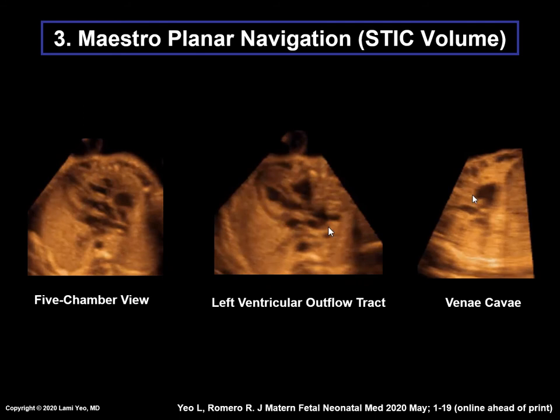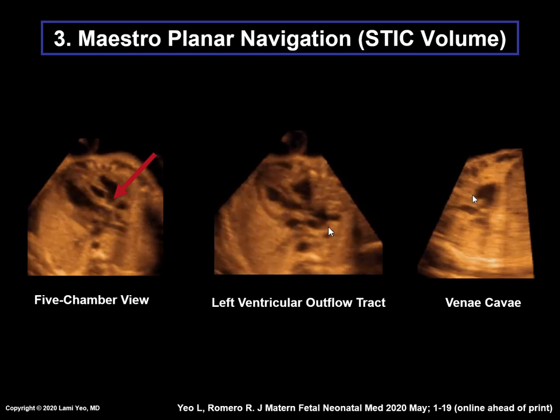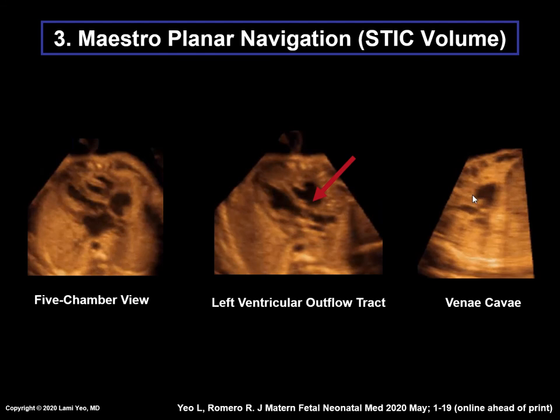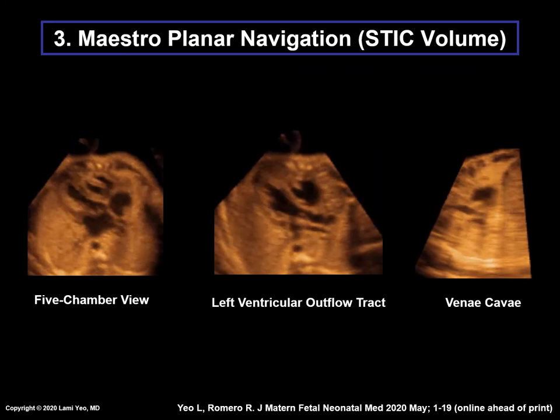Looking more closely at the fine-tuning of each of the three cardiac views: for the five-chamber view, which initially shows the longitudinal view of the aorta, Maestro Planar Navigation successfully obtains the aortic root instead. In the left ventricular outflow tract view, the longitudinal aorta is now shown nicely. Finally, in the vena cava view, the inferior vena cava was not initially seen, but Maestro Planar Navigation now depicts the inferior vena cava well. Notice that there is no multiplanar view or reference dot visualized.